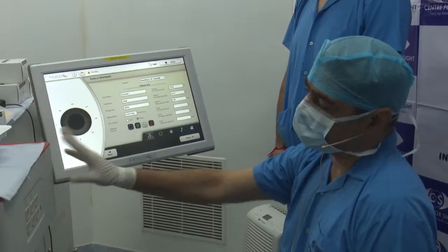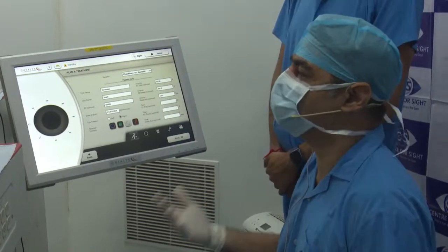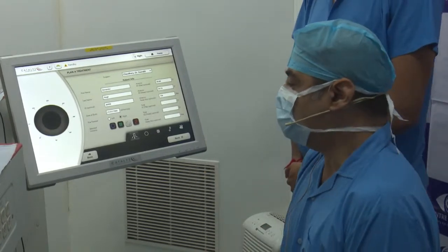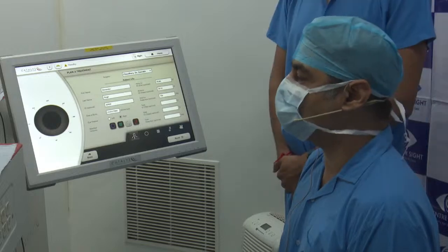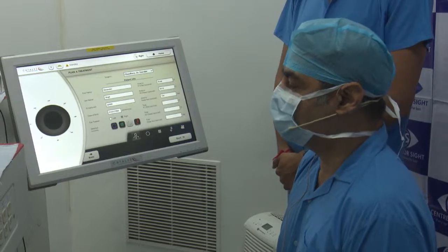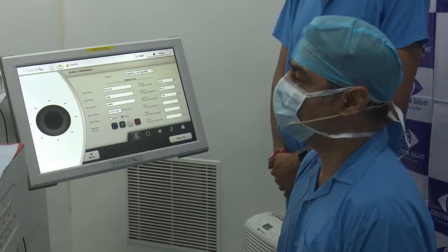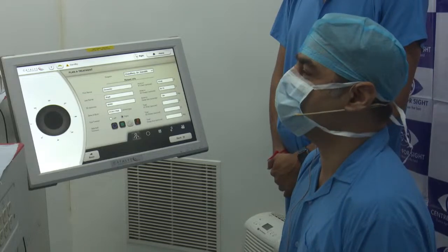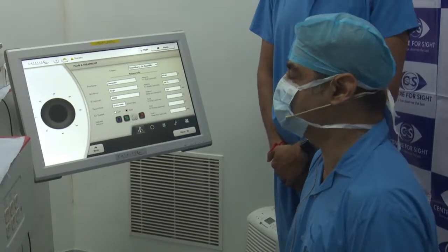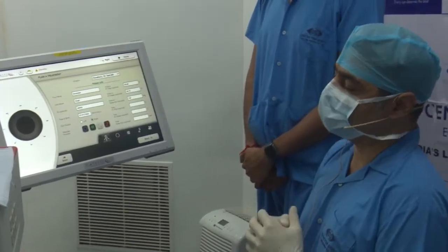The first question is why a femto? A lot of surgeons come down to ask me why a femto, and I feel that it is the need of the hour. It's not because of the technology; it's because of the demand of the patients. Why did we get a femto? Because we were losing a lot of patients from our practice who went away because they needed a laser cataract surgery. So that's my simple answer to that.